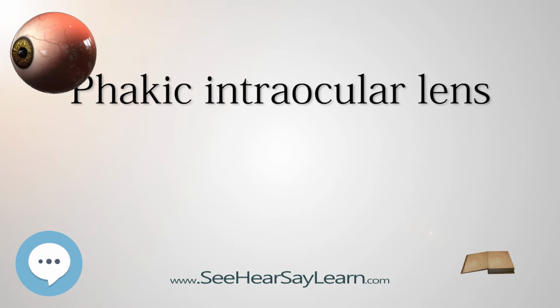Complications. Glare and halos, which may cause nighttime symptoms especially in patients with larger pupil diameters. Cataract, which is the most crucial concern for the sulcus-supported PIOLs. According to FDA, approximately 6% to 7% of eyes develop anterior subcapsular opacities at 7+ years following implantable Collamer lens implantation and 1% to 2% progress to clinically significant cataract during the same period, especially very high myopes and older patients.